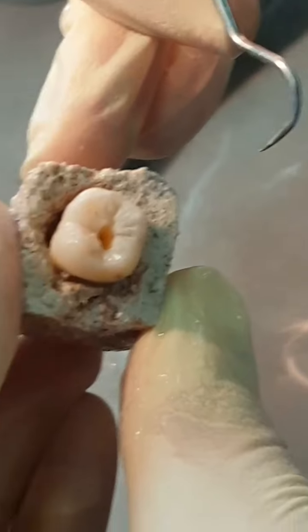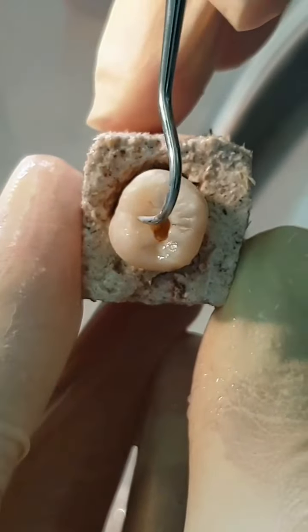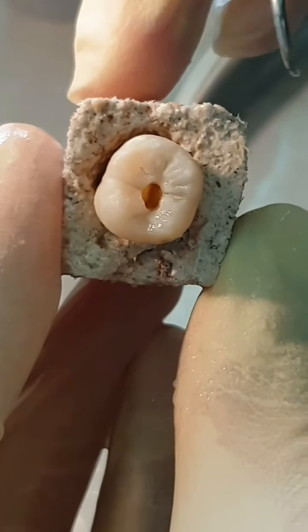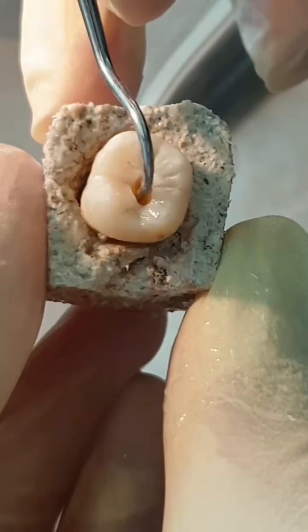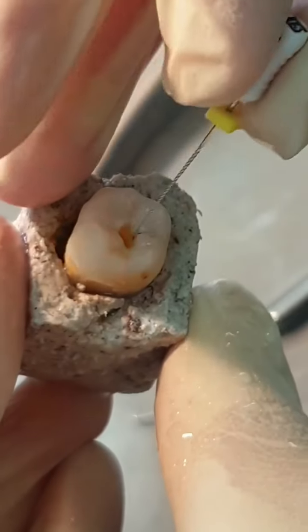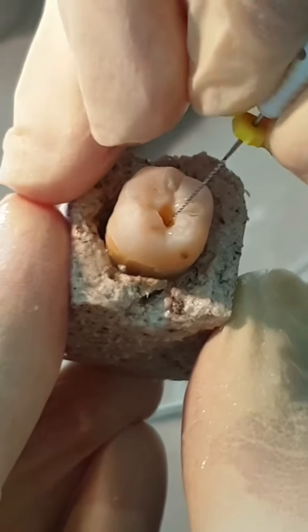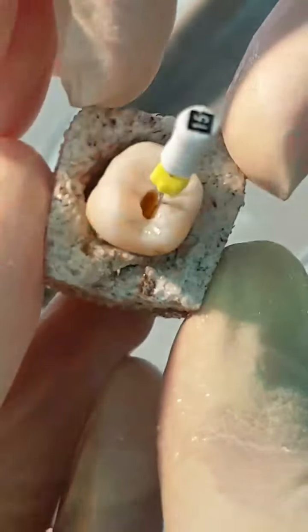Now we reach the floor of the pulp chamber. You can see those developmental grooves in the floor of the pulp chamber. You can see the distal orifice and the mesiolingual orifice too. Now we are going to check with file to locate the orifices. This is the distal canal orifice here. Mesiobuccal, no, we can't enter a file there, but yes, mesiolingual, we have found that.